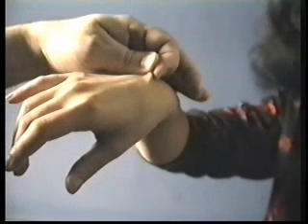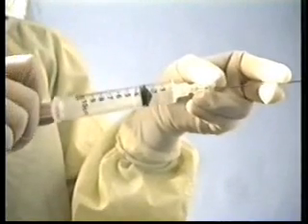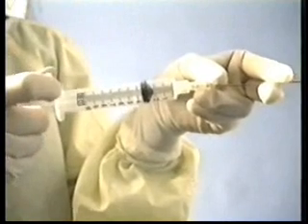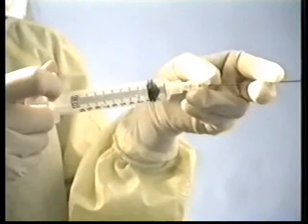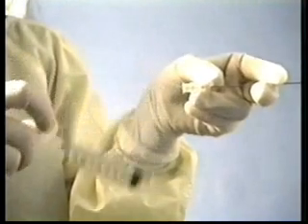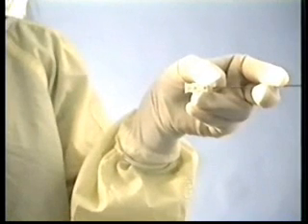What if your patient is dehydrated? Dehydration will slow the flow of CSF. Consider hydrating your patient or using a larger bore needle to enhance flow. If you are unable to obtain CSF, consider whether the needle is obstructed. Inject with 1 cc of air to dislodge any obstruction. If no air or CSF returns, then you are probably in the epidural space and need to advance.